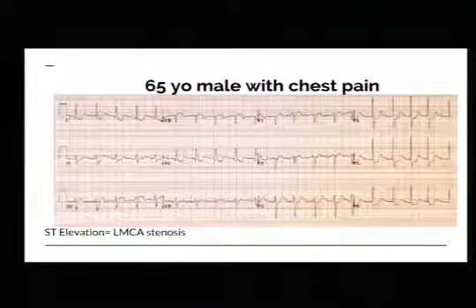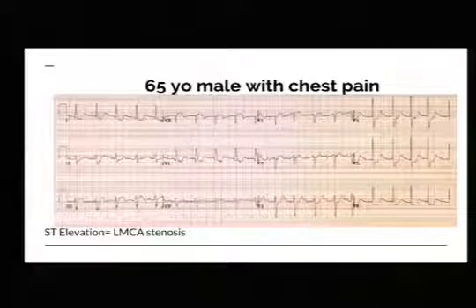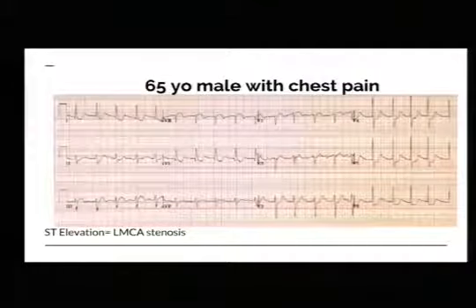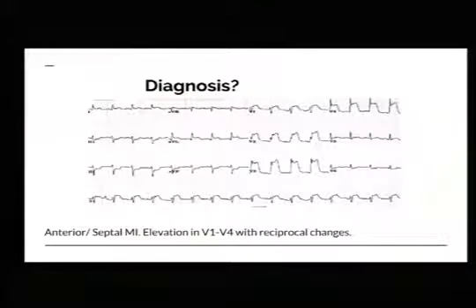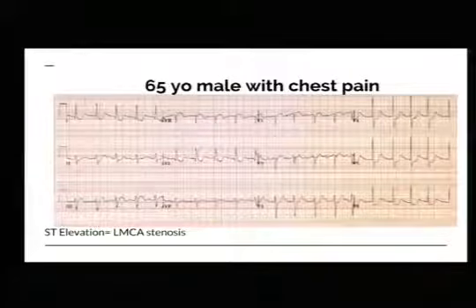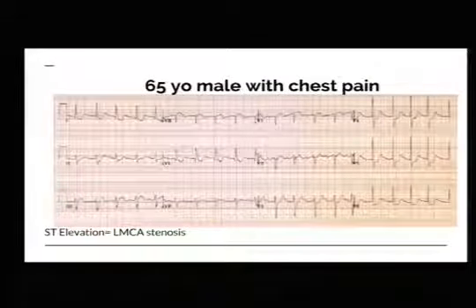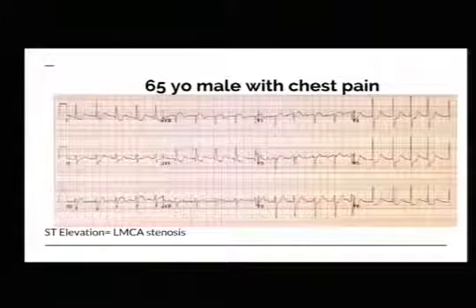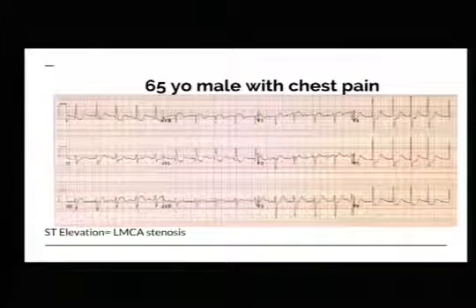And that one that popped up. So, where do you see your elevation in this one? Fortunately, the answers showed up. I'm supposed to trick you guys on this one, but. So why is this one a left main since the answer is down there?